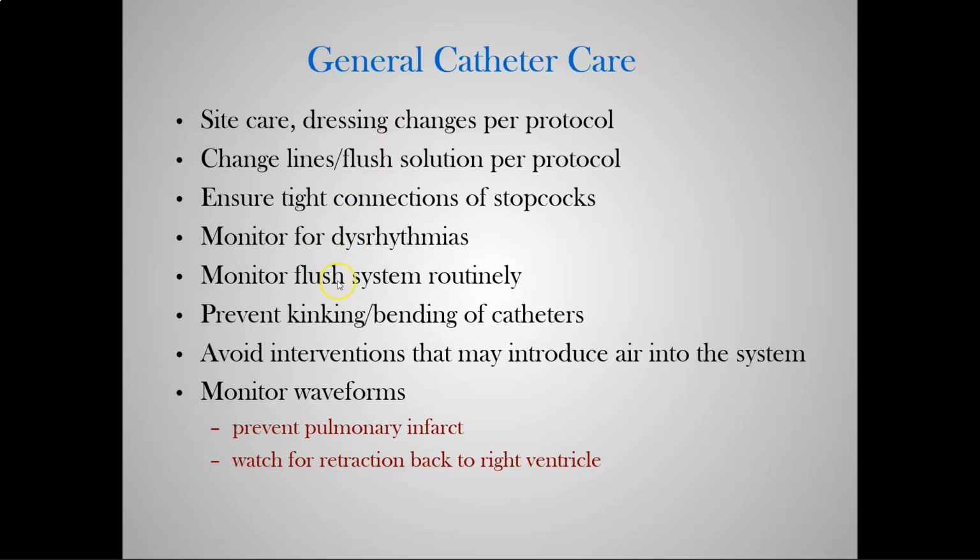We're going to monitor our flush. We're going to flush regularly. I like to flush at all of my assessments, not a long one, just a brief flush. Make sure my waveform's good. Okay, everything's zeroed, leveled. All right, sweet. No kinked, bent tubings, no catheters that are kinked or bent. Everything's good. Avoid interventions that may introduce air.